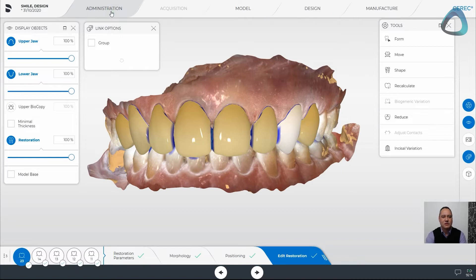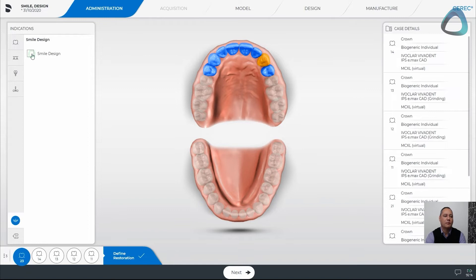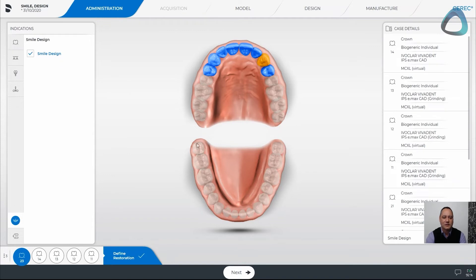If we jump back into administration, we can see on the left hand side we have an additional icon called smile design. All we've got to do is put a tick in the smile design box. This can be done at any time through the case — if you've already done the case and decide you want to bring smile design into play, simply come and activate it when you're ready.